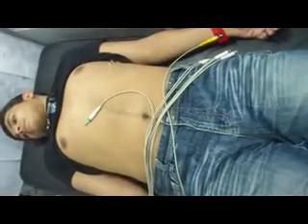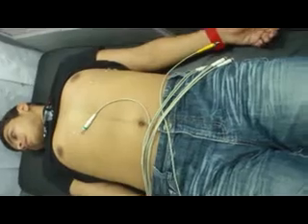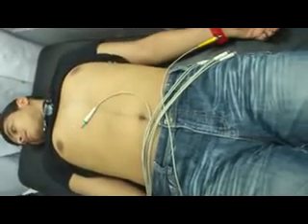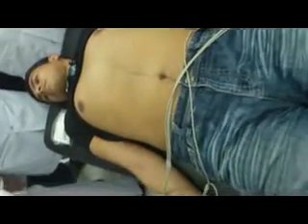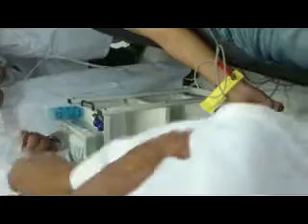Now, where are the electrodes? First of all, you can see the color of the electrodes, all the same color. Because I told you, electrodes, no matter what, leads are important. Okay? So very quickly, because I have put the gel, just attach an electrode to each. Take one set, attach one. Okay? Attach. There are more. No. Attach here. Very quickly. 2 more here. Quickly.